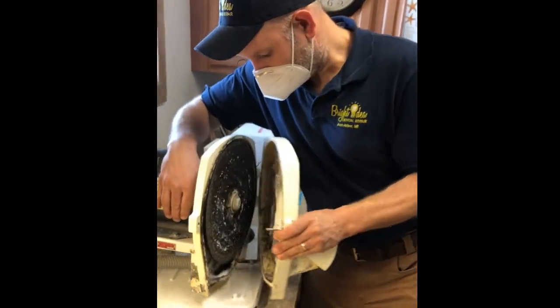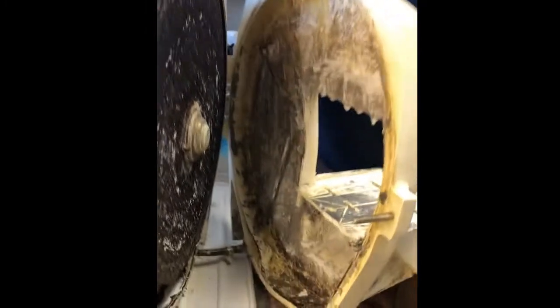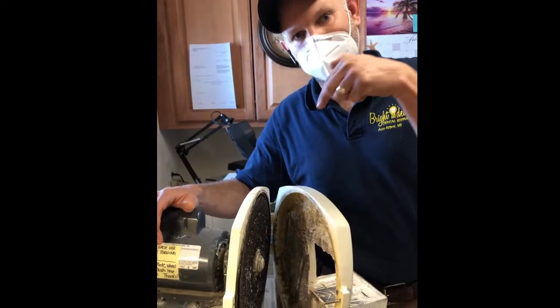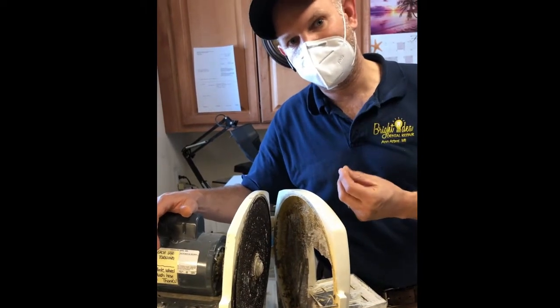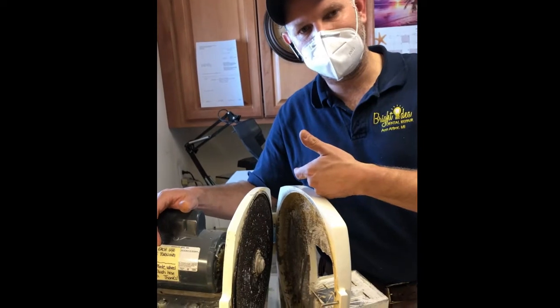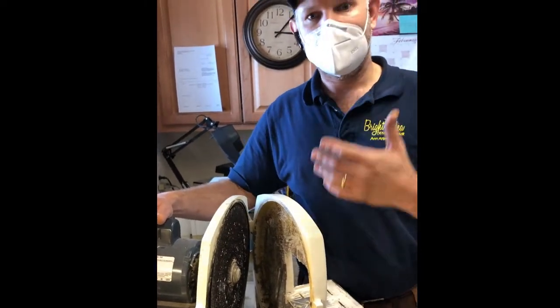So this tube is sealed at the end. What we're going to do is actually cut the end of the tube off with a high-speed handpiece. Then we'll run a cleaning rod down through the top and clean it out from this way. And then when we're done, we'll re-pinch the tube. So I'm going to take this over into the operatory. We're going to cut the top off with a high-speed handpiece, and then we'll show you the cleaning rod mechanism when we get back here.